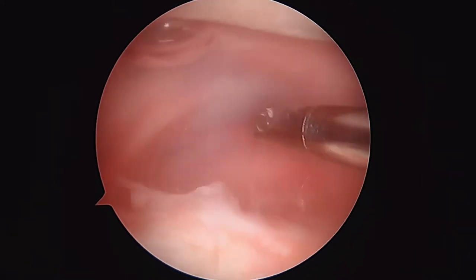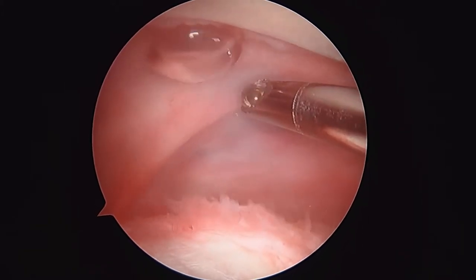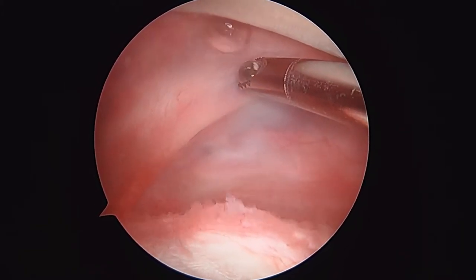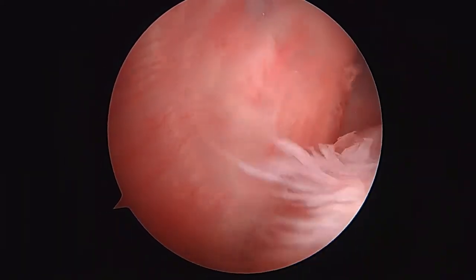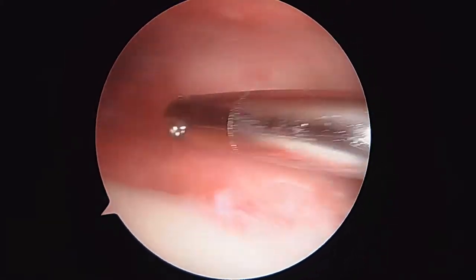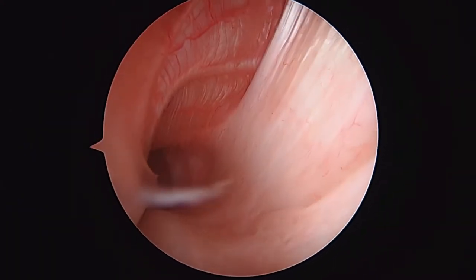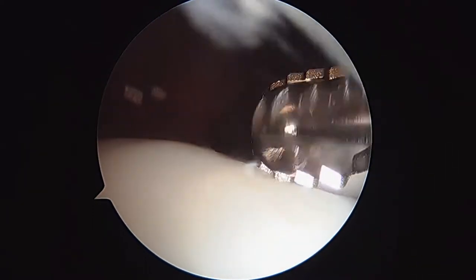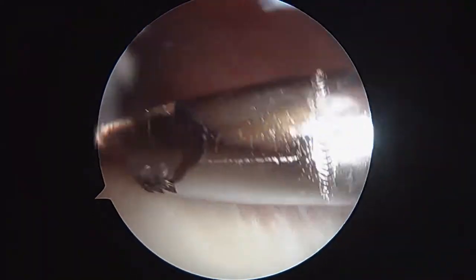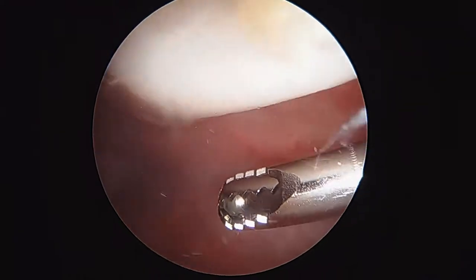As you see, I don't see any bleeding sources inside the joint, which is one of the things we had talked about. That looks very clean. The medial gutter looks pristine — no signs of any problems. To sum up this part of the knee: the patellofemoral joint and the suprapatellar pouch look pretty good. A little bit of a hypertrophic fat pad, but nothing that really requires any significant surgery. The articular surface on the patella looks pretty good.